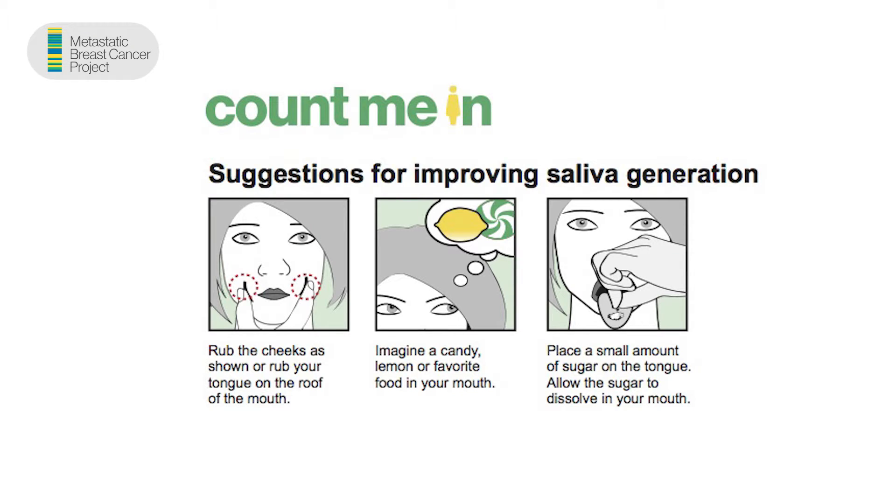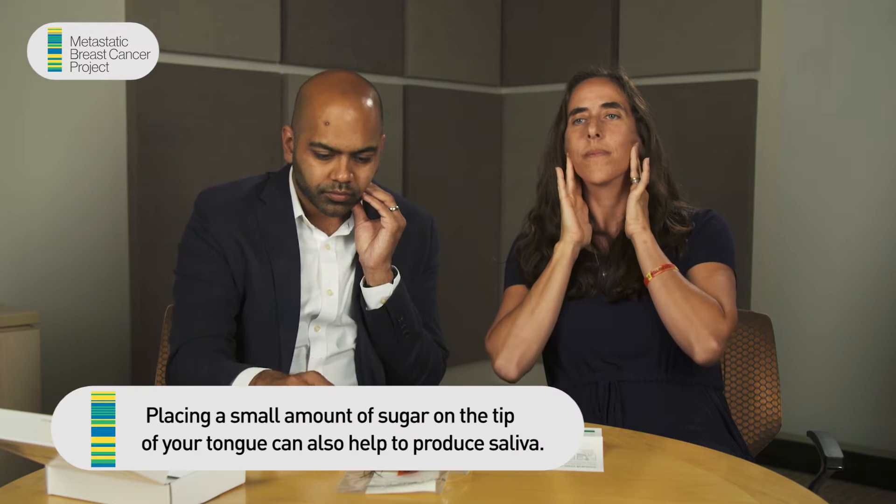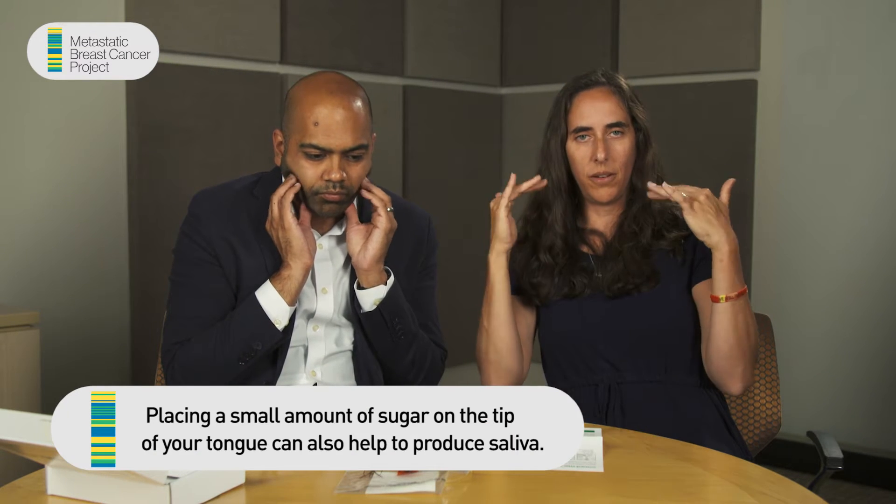Before you do that, I've heard from a lot of people that it's very challenging to produce saliva if you're in therapy — sometimes that can lead to dry mouth, or sometimes you have mouth sores. They've provided really excellent guidance. Some of the things you'll find in the instructions are that you can massage your cheek like this, which helps produce saliva. Another thing you can do is envision something very sour — even envisioning a lemon will actually trigger a saliva response.